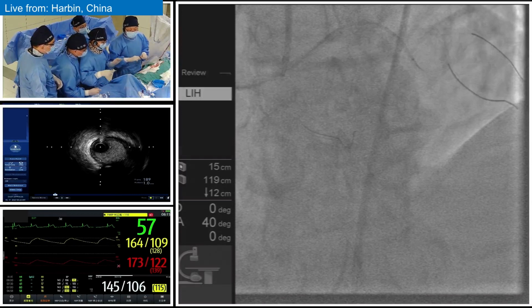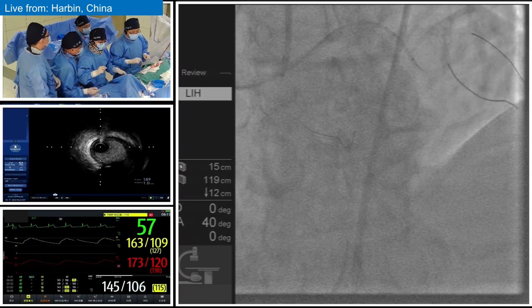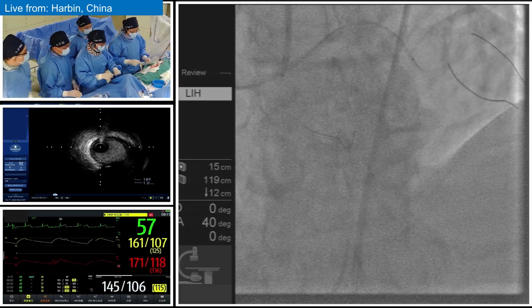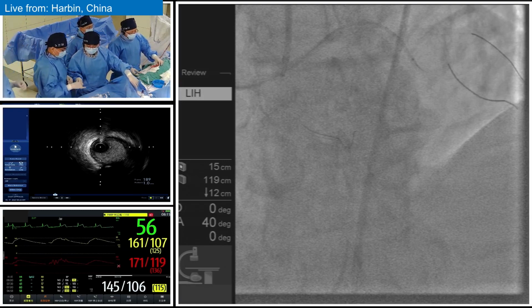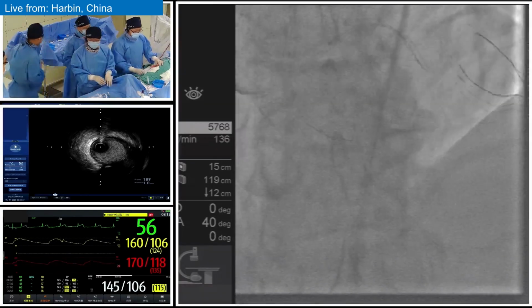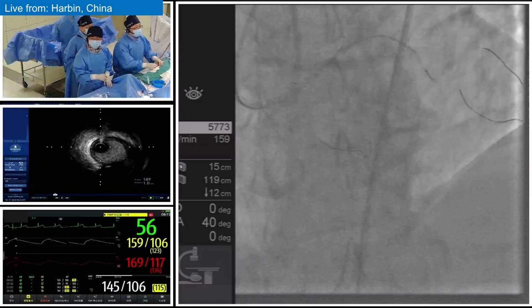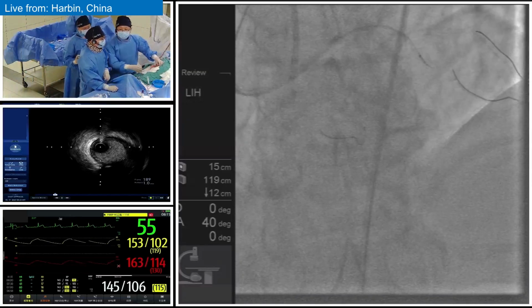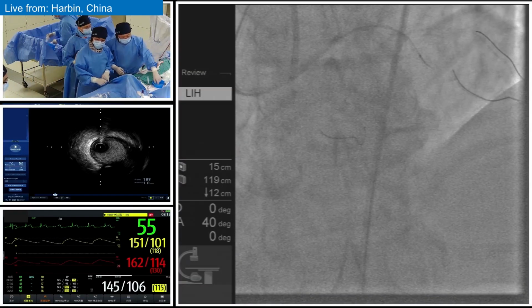Okay, give me a Miracle 12, please. So we switch from, I think, a Fielder family to a Miracle family, and next we are going to proceed with the ADR and the strategy. There are several things that we need to discuss.